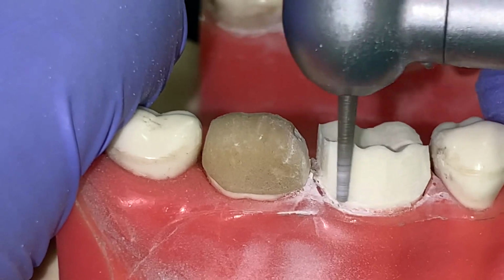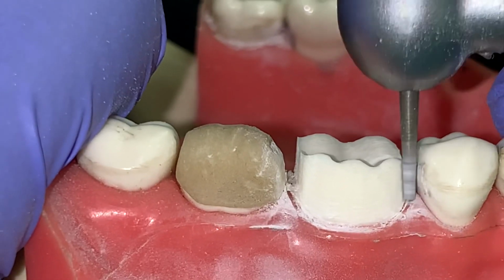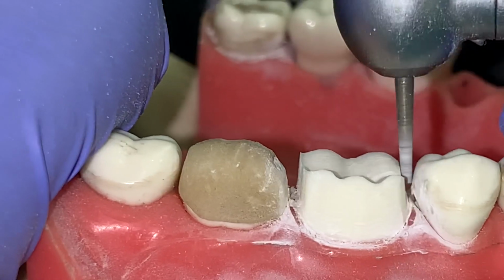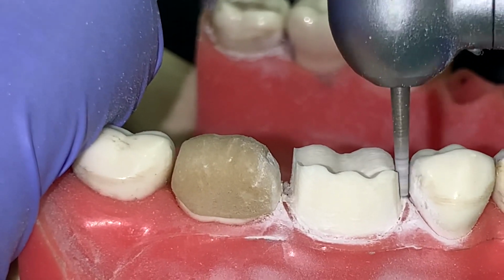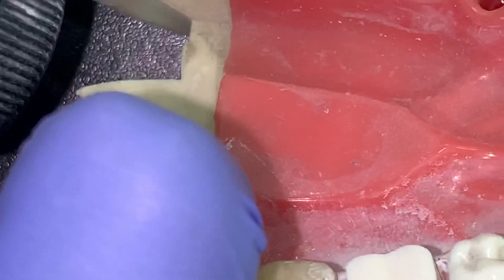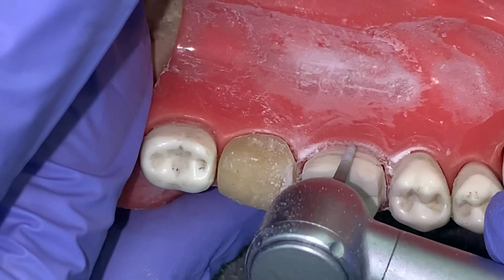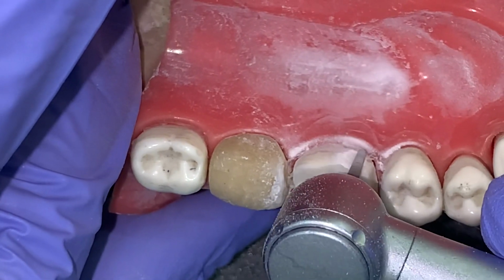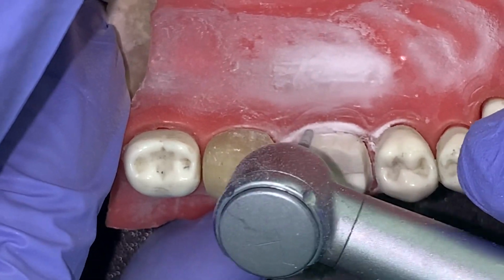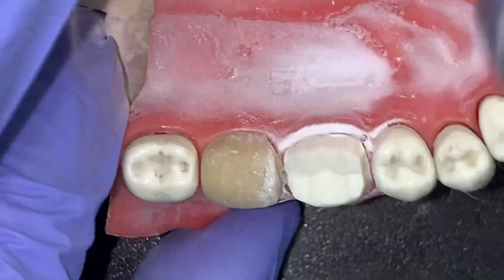Now I am again using the flat-ended burr. And very carefully, I enter the proximal areas. And this is how we prepare the proximal surface without slicing the adjacent tooth. The lingual reduction, we do not need to prepare the lingual wall in two planes. This is a single plane preparation. So it can be done in a pretty quick fashion.